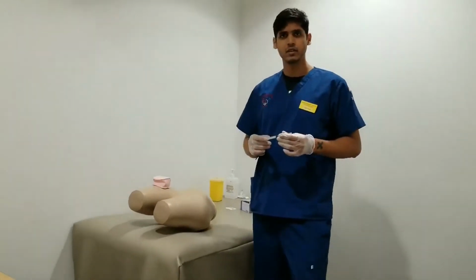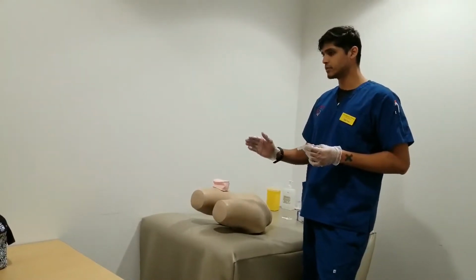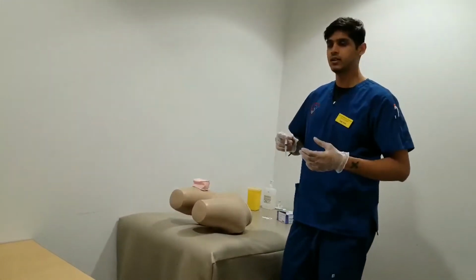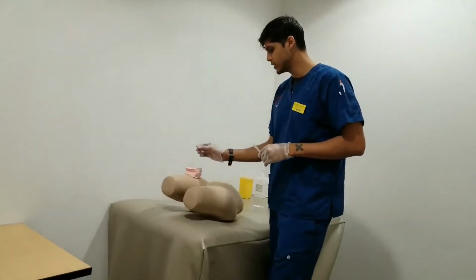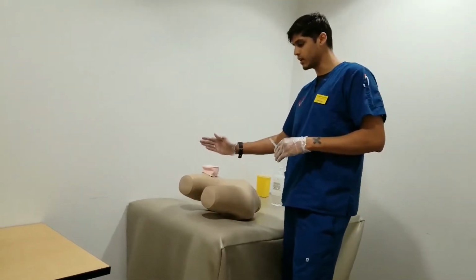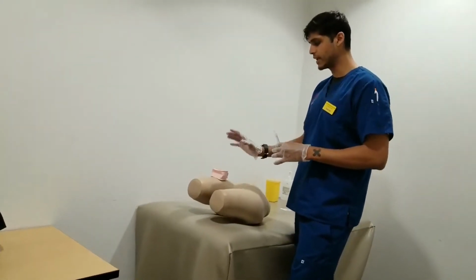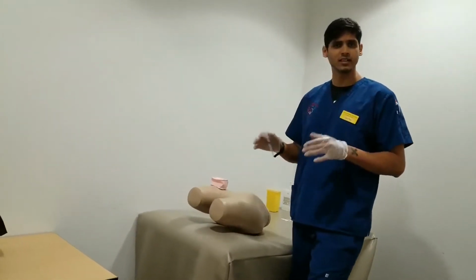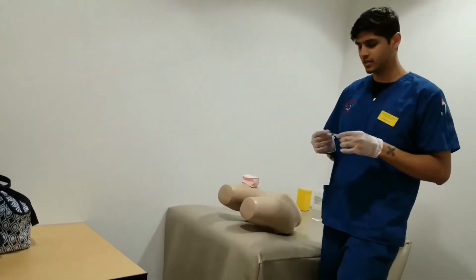One last thing I want to mention is that while doing an intramuscular injection, I want to use a pattern called a Z pattern, and that's to ensure that the medication is administered within the location and reduces chances of it being retracted. A Z pattern is moving the muscle, the mass of the body in the area, towards one side with the hand, or you can use a pinch and make the skin more taut. In that area where the skin is more taut is where you would inject. Hold it there for about 10 seconds and then remove the syringe afterwards. This will allow for dispersion and prevent medication from coming out.